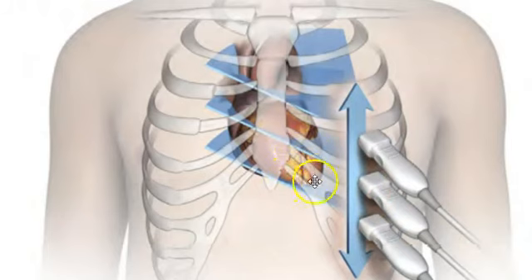You're going to miss this part of the ventricle, the apical part, just because you moved up a rib space. Sometimes you have to do that because you just can't get down into this and can't see anything from down here. You're too far away.